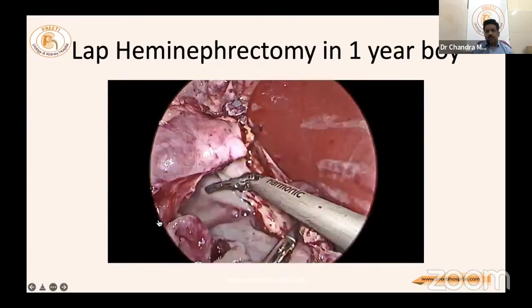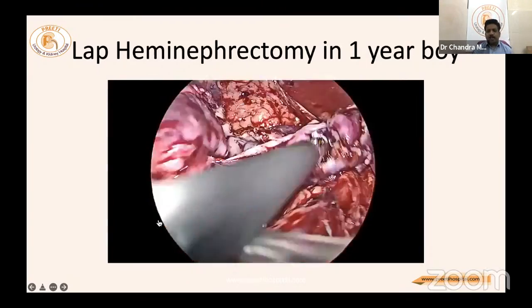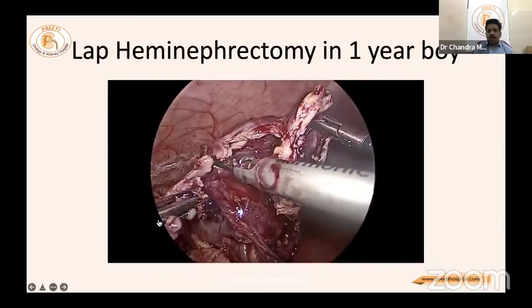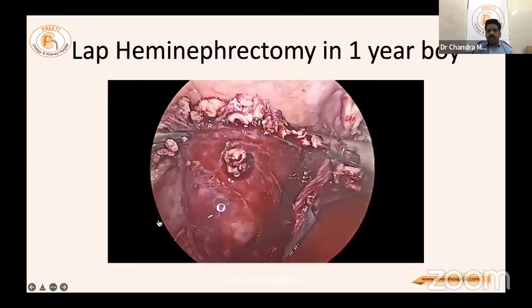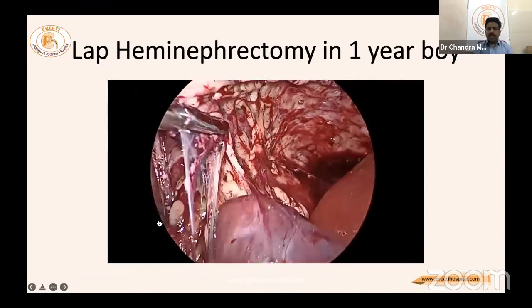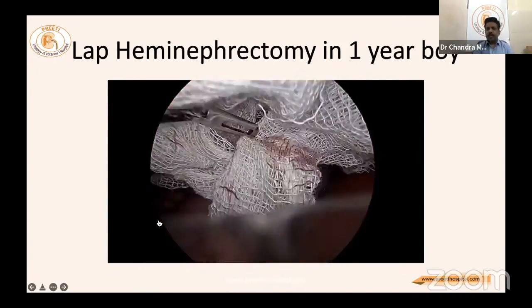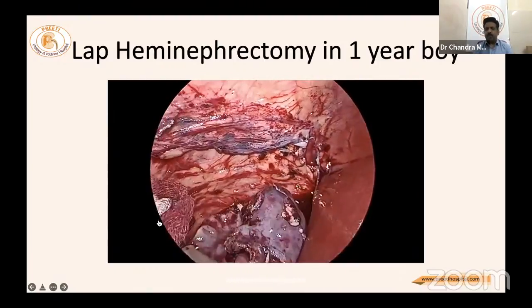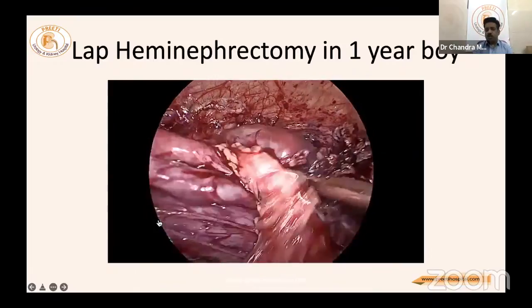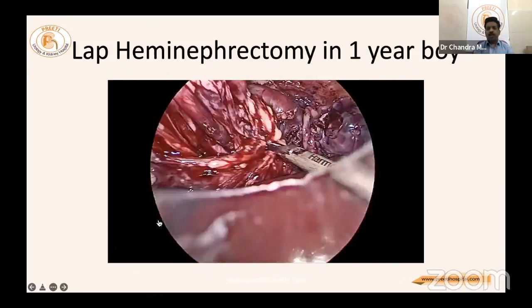The upper pole system is detached from the kidney — the lower and upper poles are clearly separated. Do not be overly enthusiastic about cutting the parenchyma of the lower pole as it will bleed. Leave a tag of tissue with the lower pole so that it does not bleed, as it has normal blood supply. This is difficult in a small child, especially in a pyonephrotic kidney. Do not try to coagulate the surface of the leftover kidney.